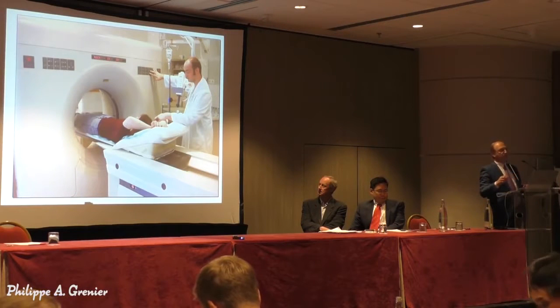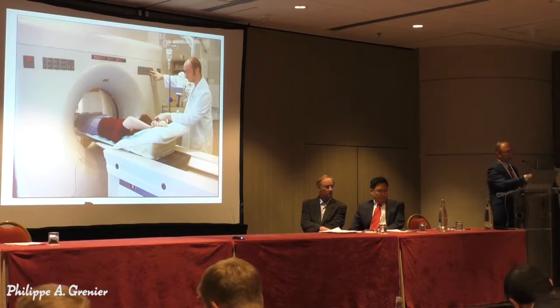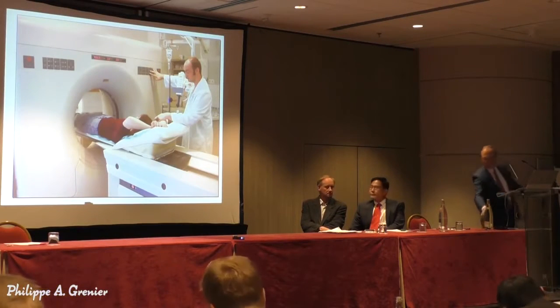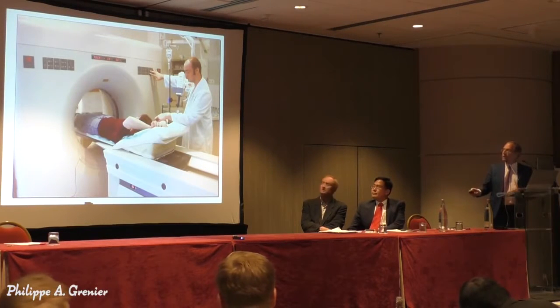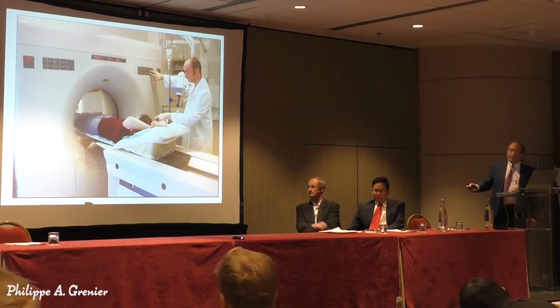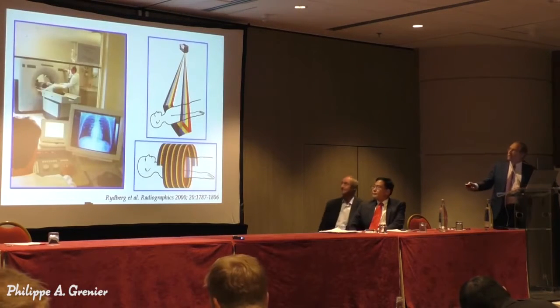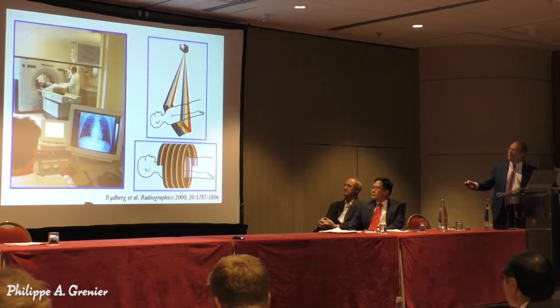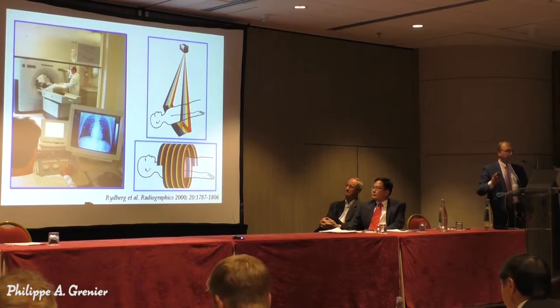For those who do not know the principle of CT acquisition, in the circle here, in the tunnel, you have the tube and the detectors. And this is rotating very fast, a 360-degree rotation in 0.3 seconds.